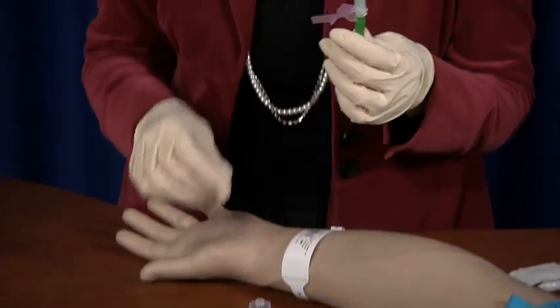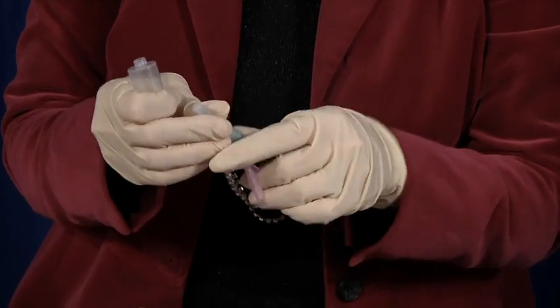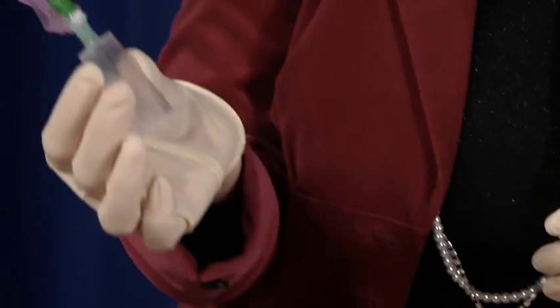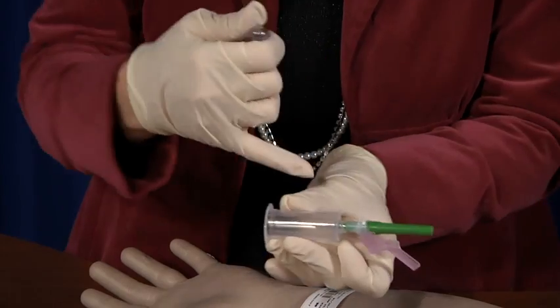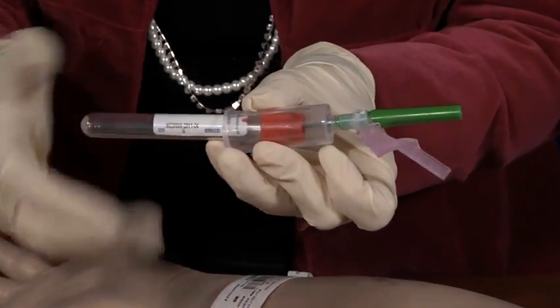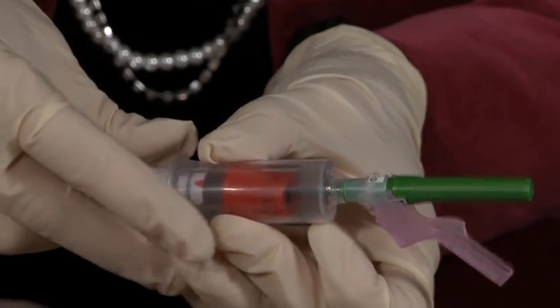Okay, this is a vacutainer needle. This is a vacutainer, so now we got to put it together. You twist it and then twist it on. So now you're ready. Pick one of your tubes, slide it in. Now there is a needle in here that will puncture the end of that tube. There's a vacuum in here. So when you puncture that on the needle, it immediately sucks in whatever, air if you're not in the vein, or hopefully blood if you are. So we're not going to initiate that until we get into the vein.